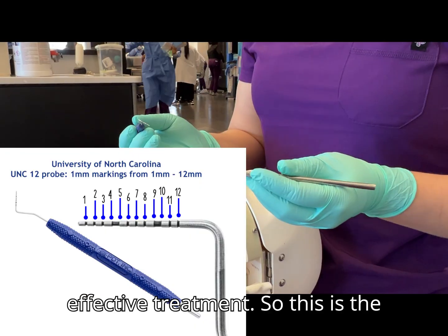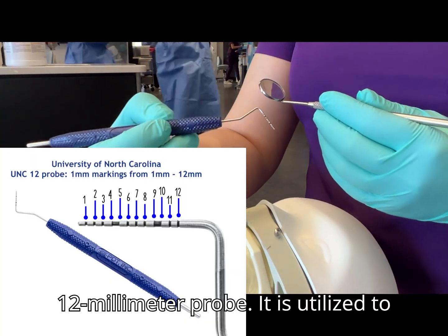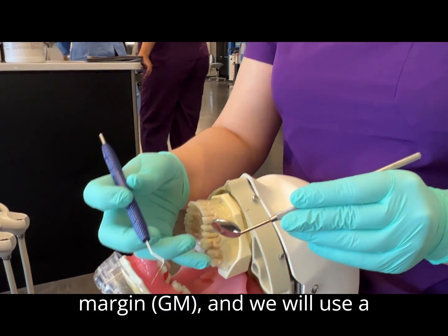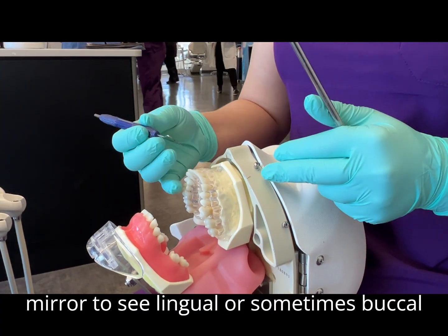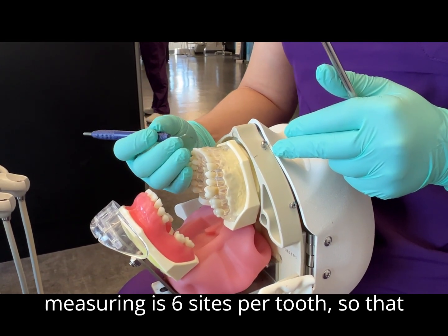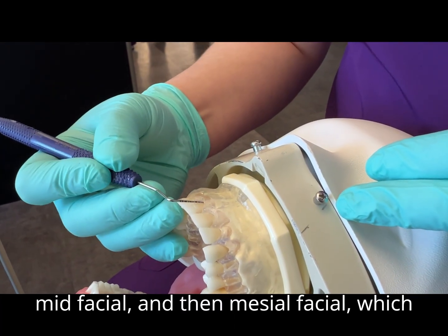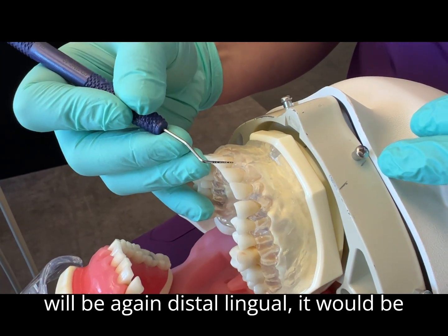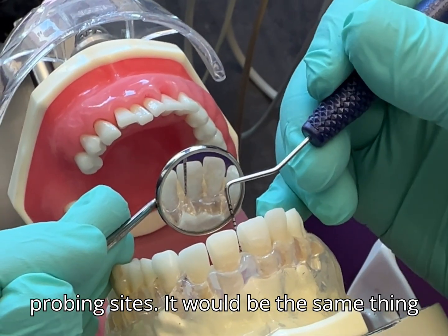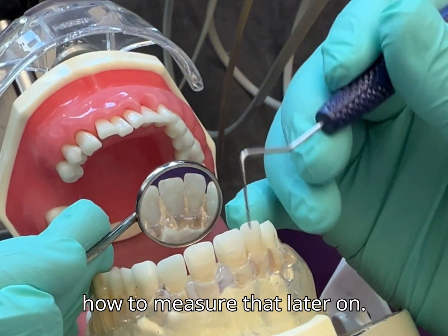treatment. So this is the University of North Carolina UNC 12mm probe. It is utilized to measure probing depth, PD, and gingival margin, GM, and we will use a mirror to see lingual or sometimes buccal areas. So what we're going to be measuring is 6 sites per tooth. We go from distal facial, mid facial, and then mesial facial, then distal lingual, mid lingual, and mesial lingual probing sites. It would be the same sites for gingival margin, which I'll demonstrate how to measure later on.